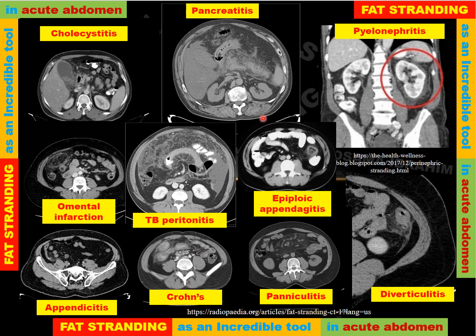So the main issue in this presentation is fat stranding, and how it can be used as an incredible tool for the diagnosis of acute abdomen.